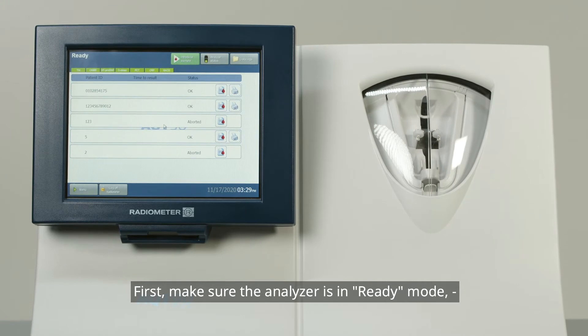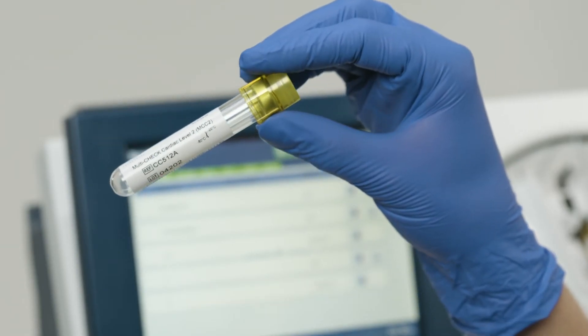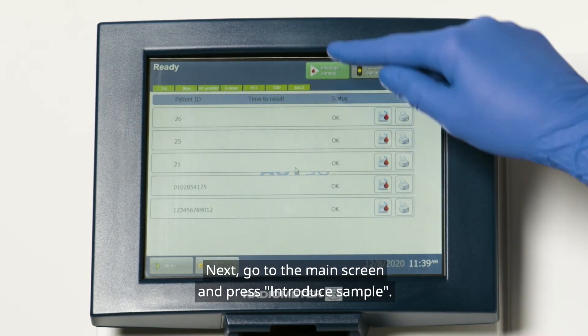First, make sure the analyzer is in ready mode and the LQC has been thawed. Next, go to the main screen and press Introduce Sample.